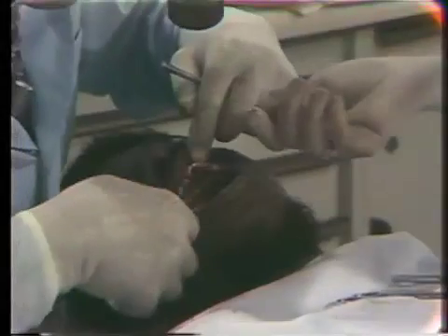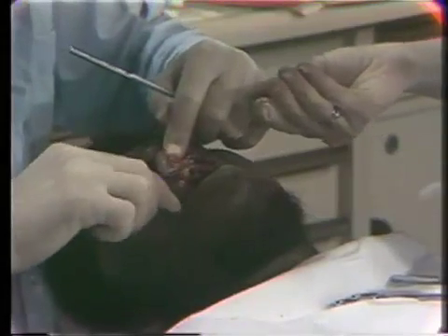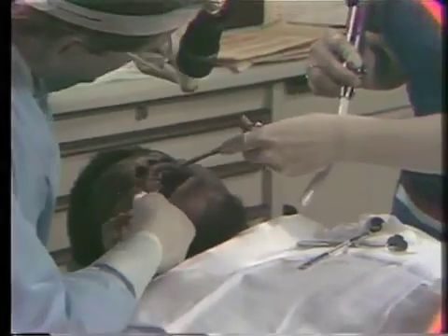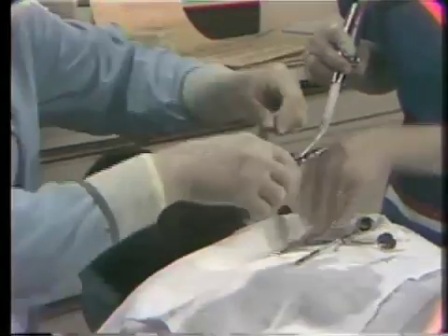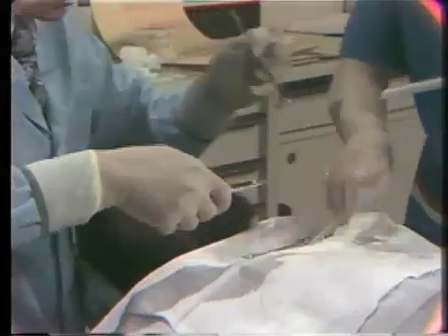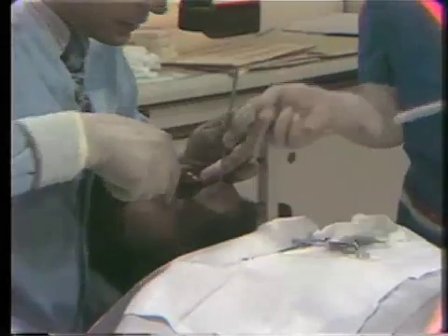But now we've sutured the area from the left central incisor to the distal of the first bicuspid. And now we're going to be ready to tie the knot. And she has the suture shears ready to incise. And notice how she even picks off the small end of the suture material that we just cut. Pick it up, Betty. Pick up the suture. Yeah, underneath that. That's it.